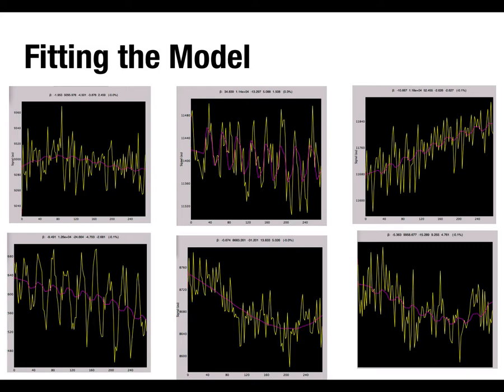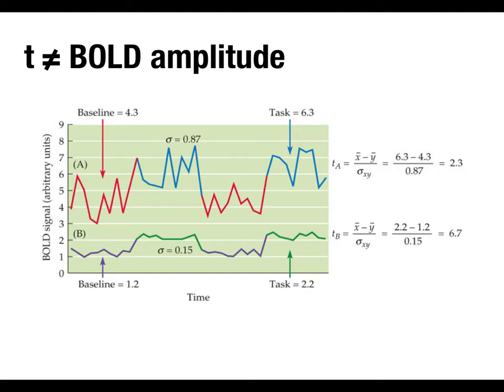So when you see something in a paper where somebody has shown a brain and there's some bright, beautiful blobs of activation on it, what they've done is this kind of correlation, right? Found those brain areas or those individual voxels that showed a systematic pattern, and then applied some statistical threshold to it to say, okay, let's see only those voxels that are above p equals 0.05 or whatever their threshold is, and those they color in blobs.